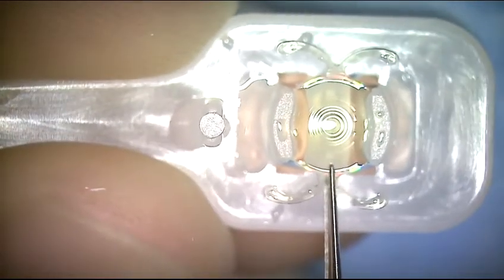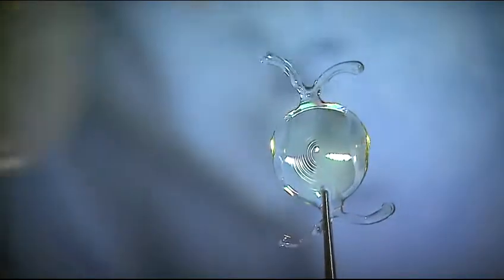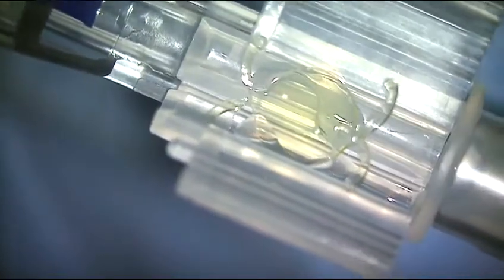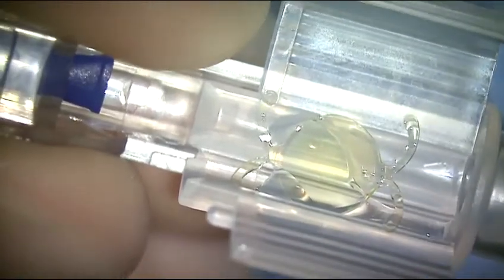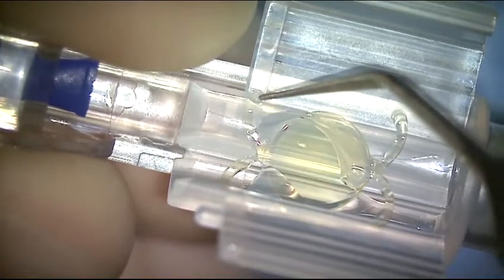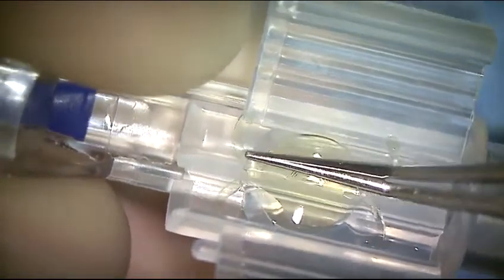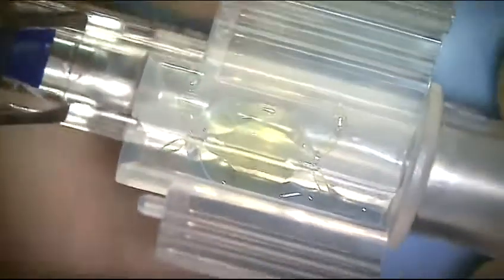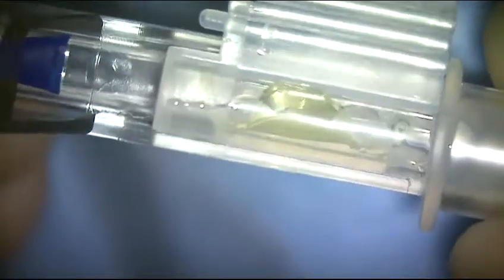Grasping the lens from the holder and putting the lens into the cartridge. You have here a hole in this haptic and a hole there, so you know that the lens is in the correct position. Then pushing the optic deeper into the cartridge before closing the cartridge, and making sure that all haptics are inside. Take your time for this step and further closure. Checking the lens in the container.